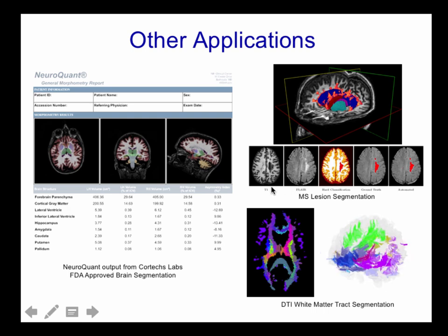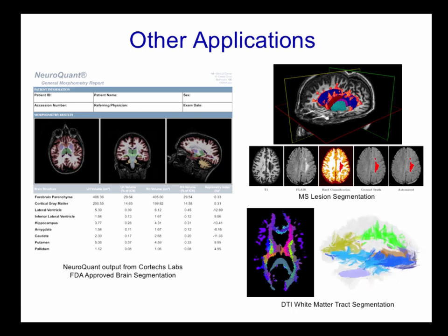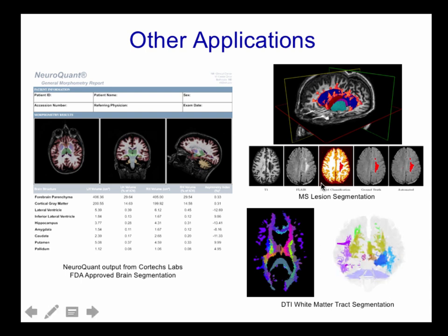It's of great interest to know how large those lesions are. This is used often in MS clinical trials. If they're testing a therapy for multiple sclerosis, they want to know whether the drug is actually slowing down the progression of lesions. So one of the typical outcome measures of a clinical trial is to see what happens to lesion volume once they've taken the drug.